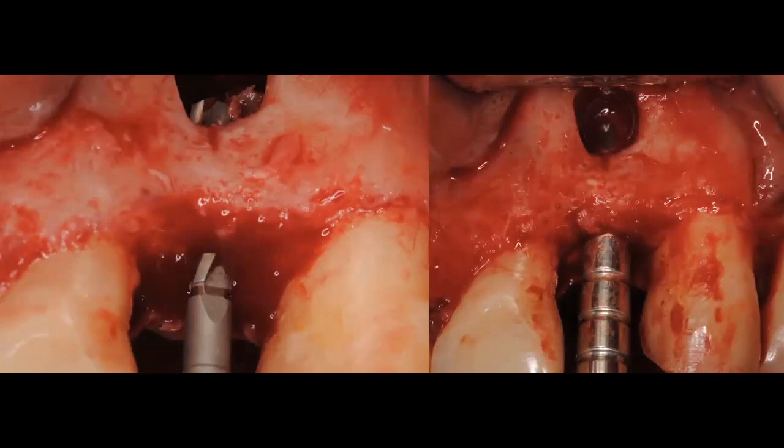Before we went ahead and performed a graft on the site, we did use a pilot drill on the site just so that we can expand the bone. Remember that we had this buccolingual defect, so we wanted to expand a little bit of that bone before we grafted, so that not only were we going to fill the height area or the apical area of our lesion, but we were going to be able to achieve a little bit of bone width during that first surgical procedure. So that's what you're seeing there.